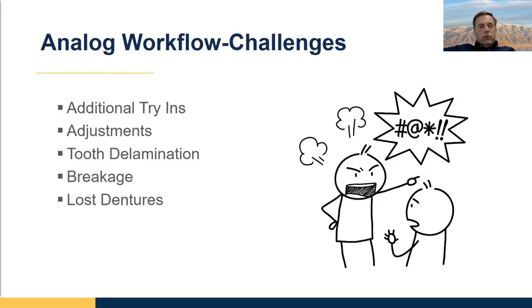With a patient with no denture, where we're doing all the steps, including the custom tray, you're looking at 5 appointments. But if you have 5 45-minute appointments at your average of $6 a minute, you have $1,350 in office costs plus your laboratory fees. So sometimes you get to the point where you're like, why would I even do dentures, especially if you start doing uncompensated post-delivery adjustments.